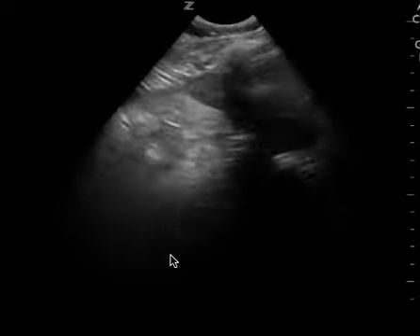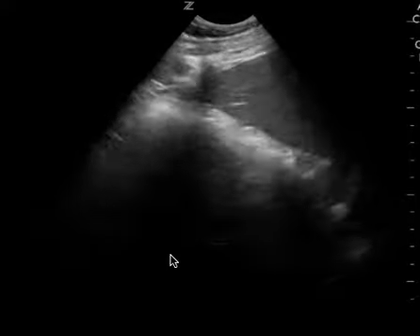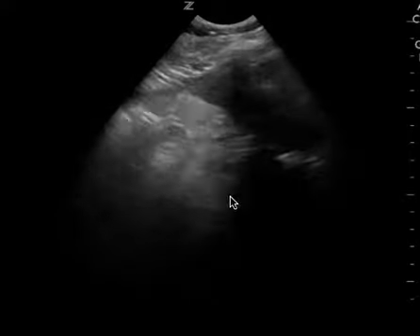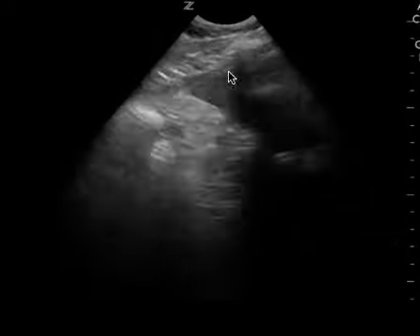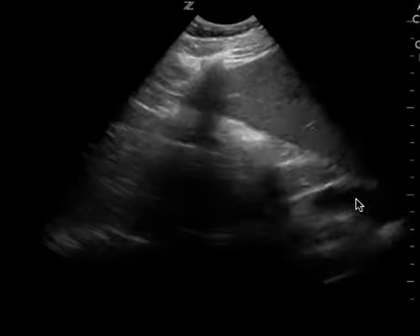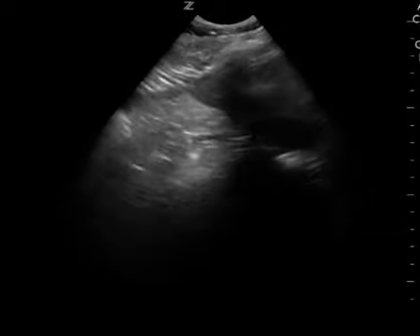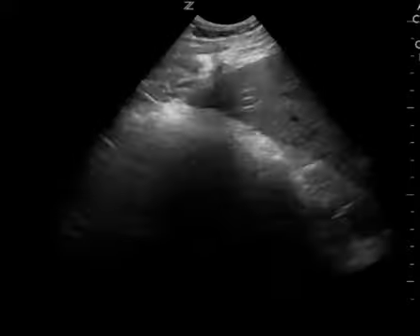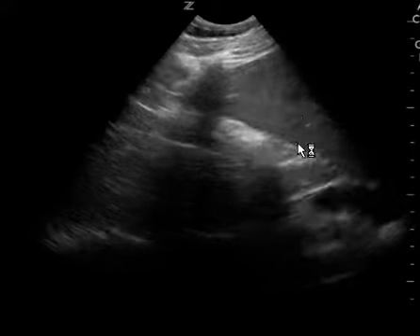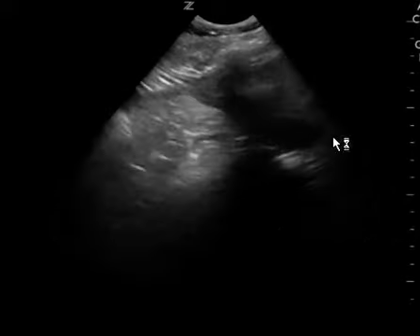As you documented on the chart perfectly, this is an indeterminate study since you can't see the interface between the liver and kidney known as Morrison's pouch. And so you can't really tell if this is the liver tip or not. Same thing here, similar view, same issues.